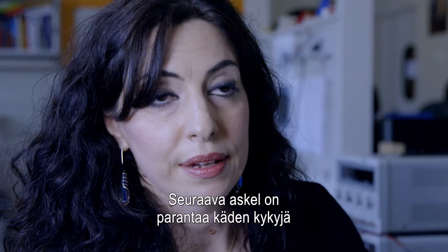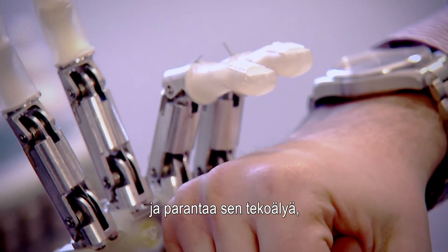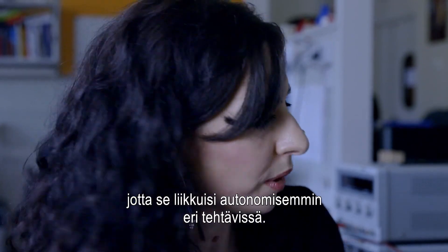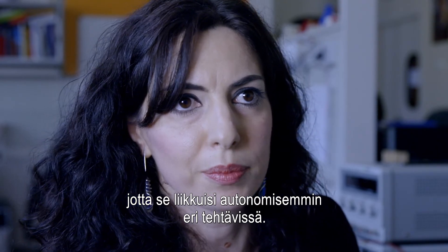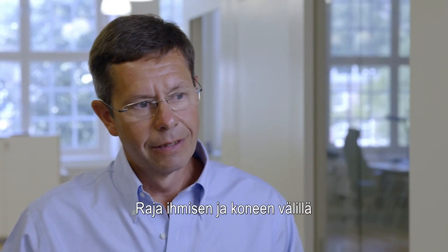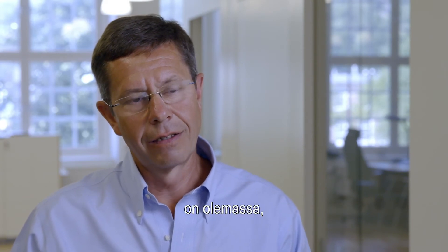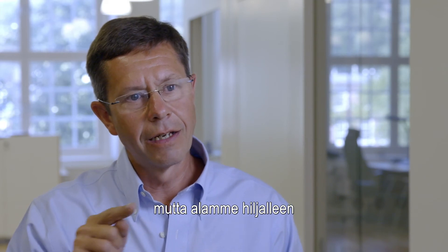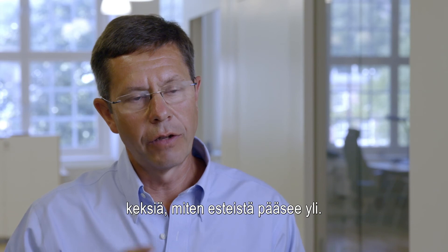The next step is to improve the sensor capabilities of the hand and improve the intelligence onboard the hand in order to make the hand more and more autonomous in performing the task. The boundary between man and machine is there, but we are slowly finding ways of bypassing the hurdles.